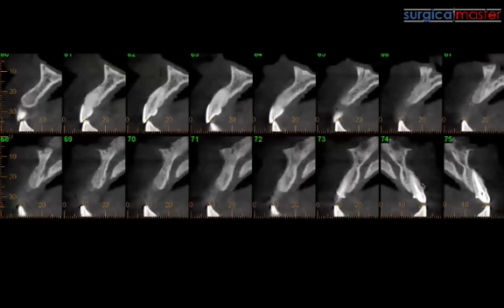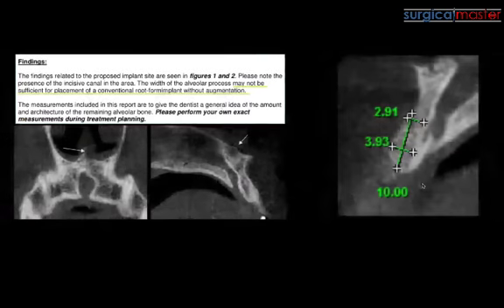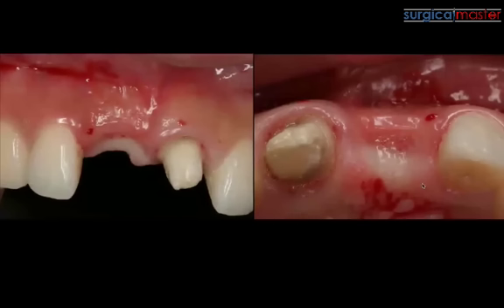And what happens after the implant has been restored? Does the tissue and bone loss continue? Actually, it does. It does continue. And that's very challenging over the years. So this is not a perfect treatment, and we're trying to come up with some other techniques that are a little bit more stable. So I naturally scanned this patient and had a three-dimensional view, and we have some collapse of the ridge. You can tell that.